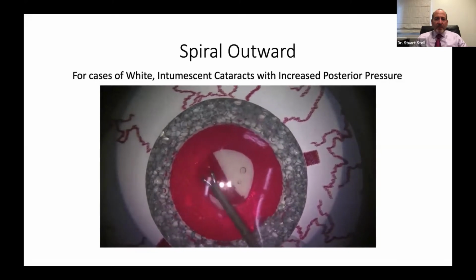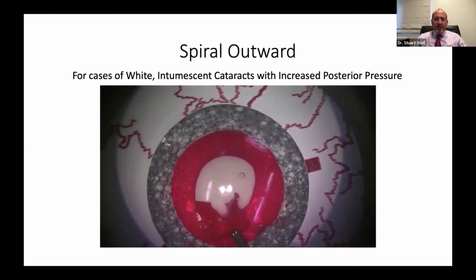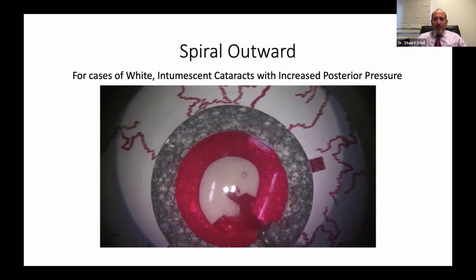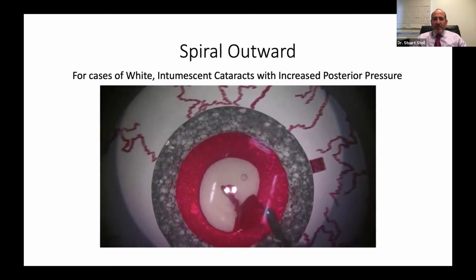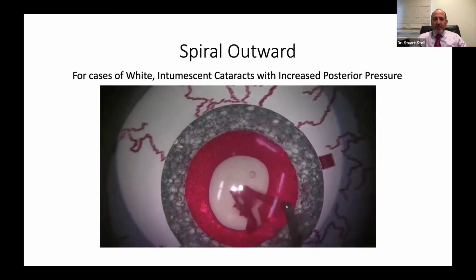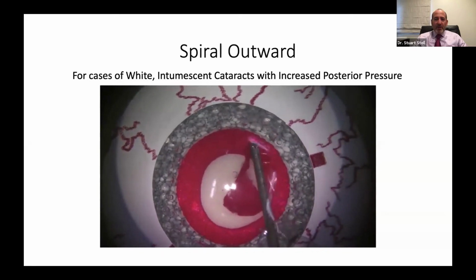We're not going to let this capsule run, even though we've dialed up the pressure, and there's a lot of pressure behind this. And you can see we're just getting bigger and bigger, tracing the tips exactly where we want that capsule to go. Fold the flap over, get the tension back on, stay wide now as you want to come around bigger.